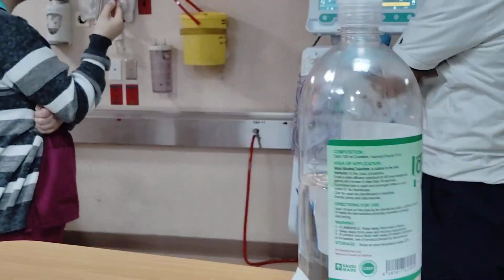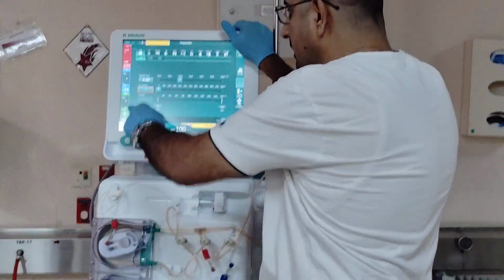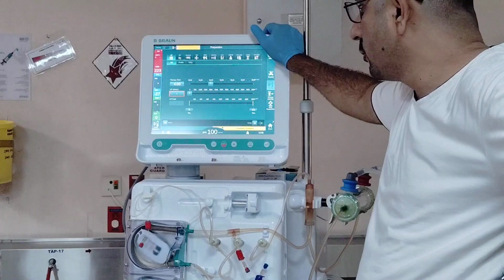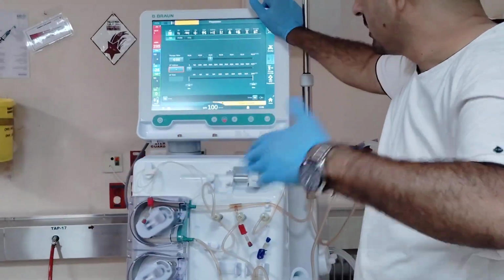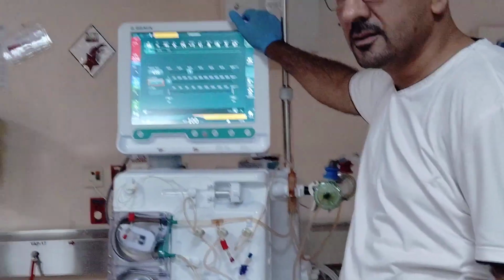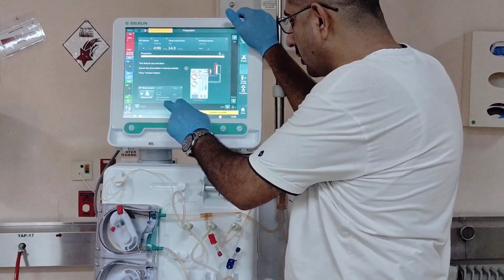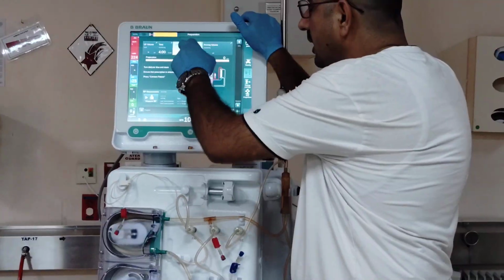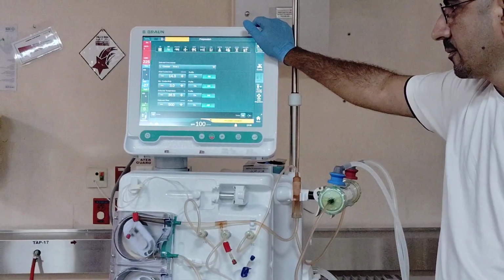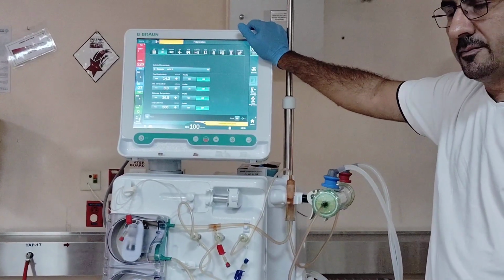The most important point: this input screen will be the most important screen, which we react with continuously during the therapy by changing the parameters. Okay, so you can reach it again by pressing here, or switch, or by this parameter or this side. Okay? Questions?